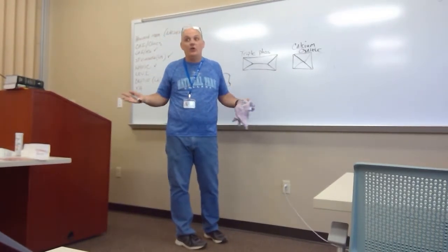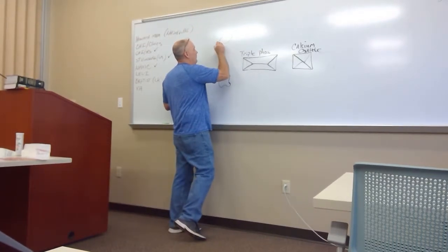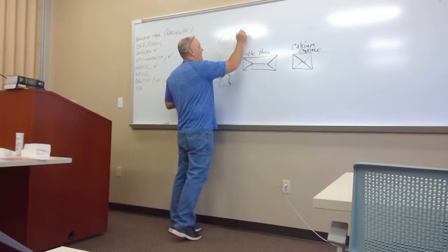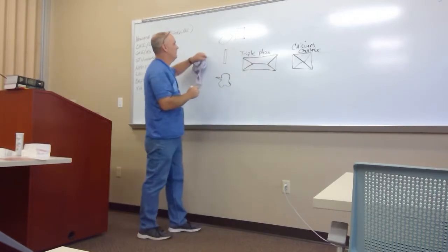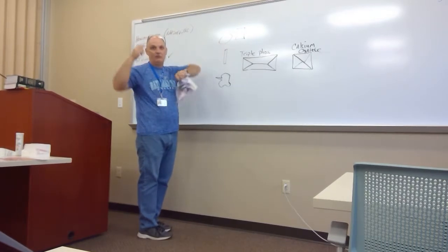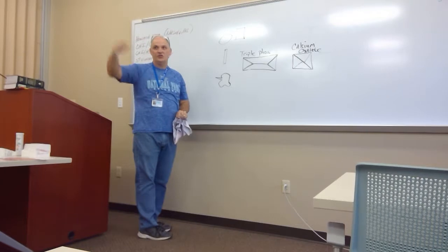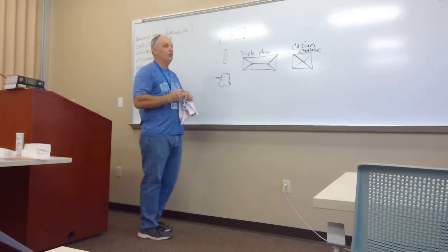Okay, so again, this is a common crystal, and uric acid. I can't really draw uric acid because I've seen them in shapes that look like footballs, in squares, and like this. These are all shapes uric acid can come in, but if I think I see uric acid, I'm going to look at my polarizing lenses and make those pretty colors flare up. And it will be in acidic urine.